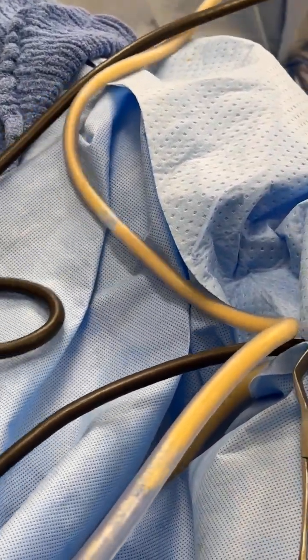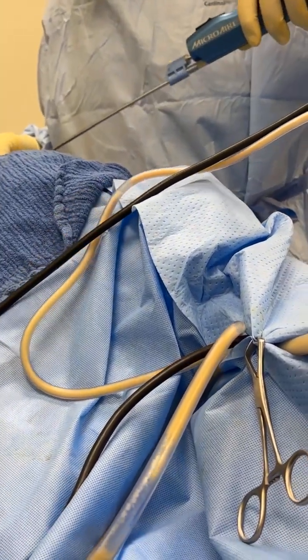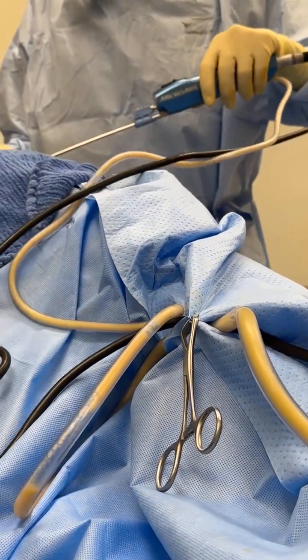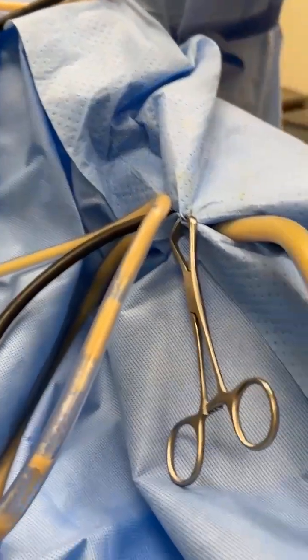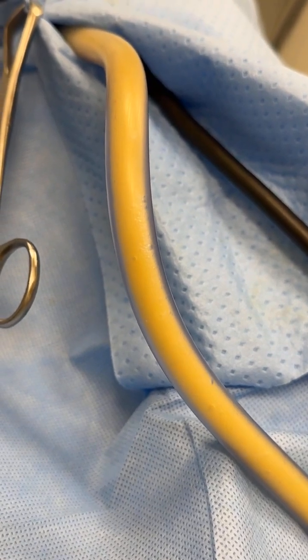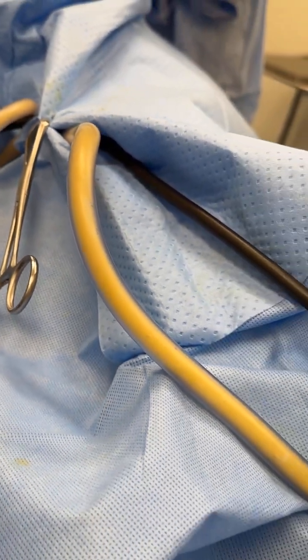This is like an electric toothbrush — you don't have to go at it. When you do that, there's going to be bleeding. Similar also to a bullet: if you put a bullet and throw it from one hand to the other, nothing is going to happen. But if you put that bullet in a pistol and shoot it at the other hand, there's going to be bleeding. So the speed of the motions that doctors make are very important.